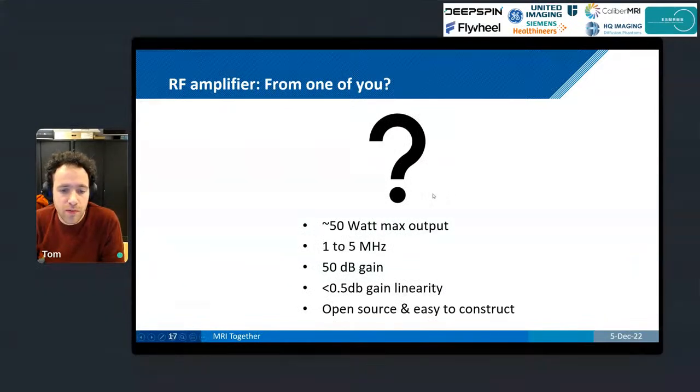If we want an RF amplifier with an absolute maximum RF power output of 50 watts, operating from 1 to 5 megahertz with a 50 dB gain, is this something that the community will be willing to design with us, so we can have a lower power system than we have at the moment and become part of the open source community?